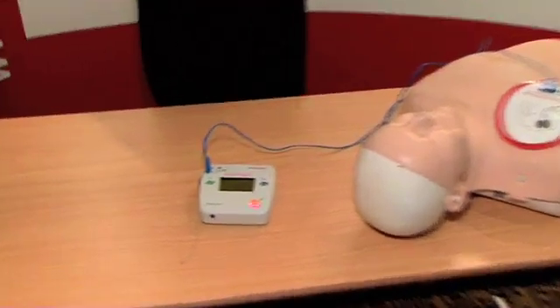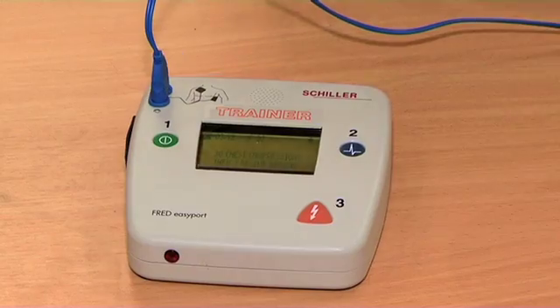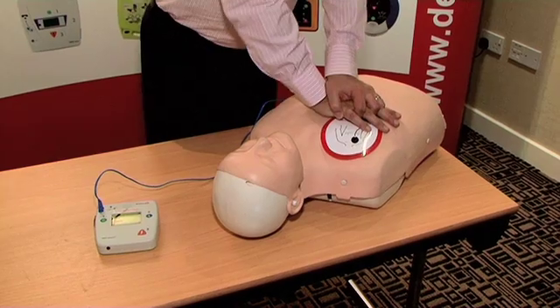Stand clear of patient, press orange button. Immediately resume CPR: 30 chest compressions, then 2 rescue breaths. Continue until patient is breathing normally.